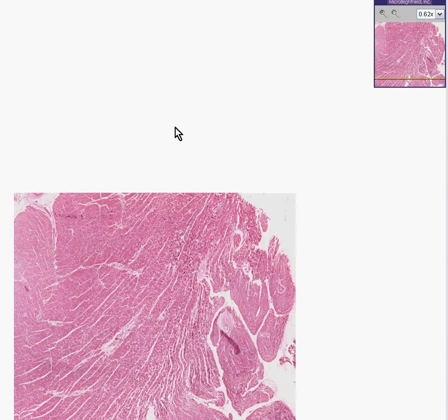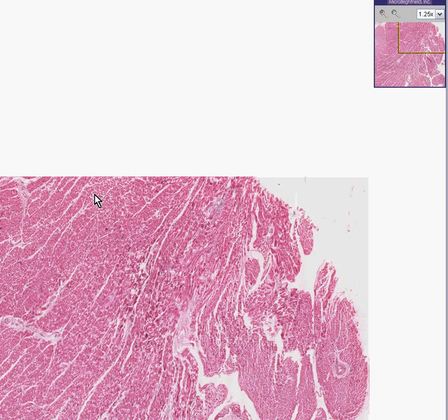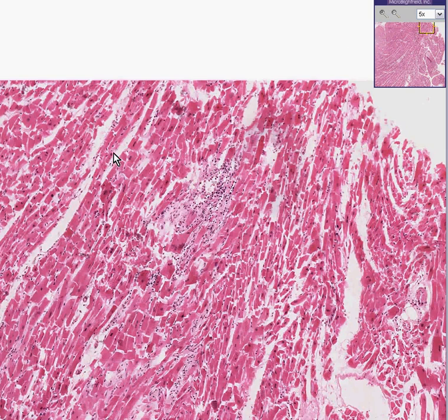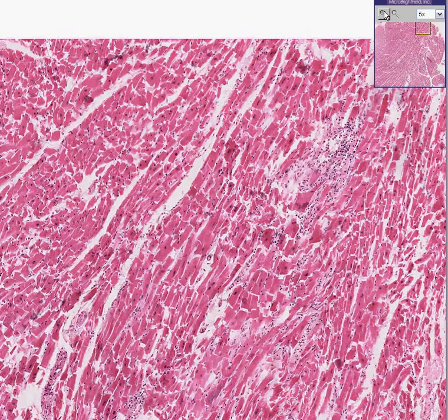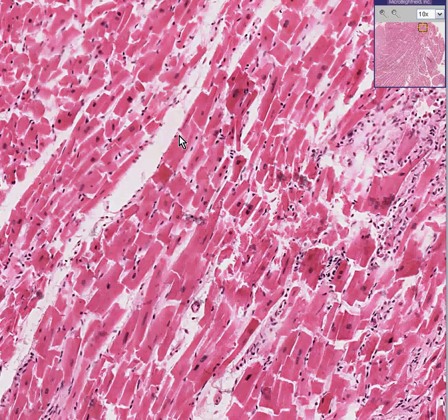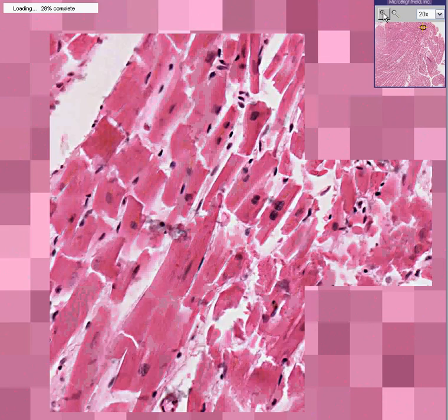No reason to spend too much time on this case. You can see it's a histologic section of some type of muscle, and because you can see what look like might be some trabeculae or base of a papillary muscle, and the fact that the nuclei are centrally located, rather square, and have abundant intercalated discs — you already know this is a cardiac muscle.